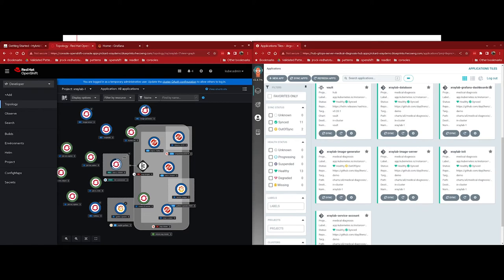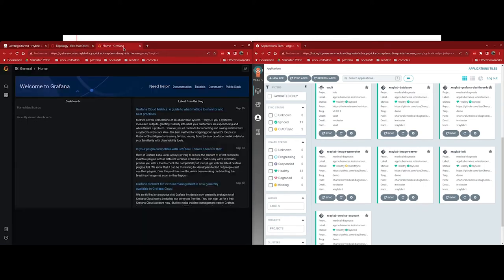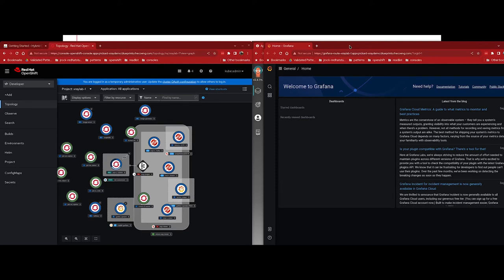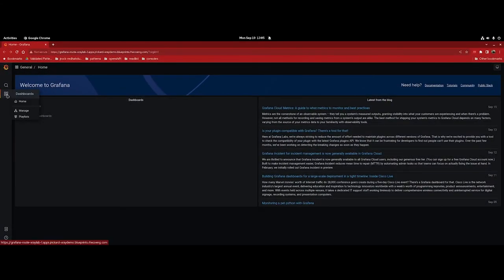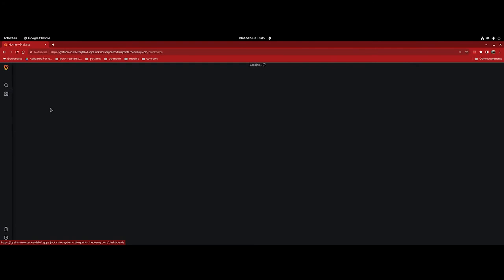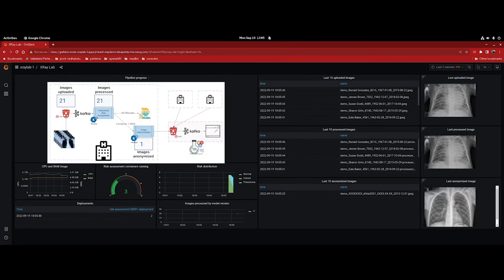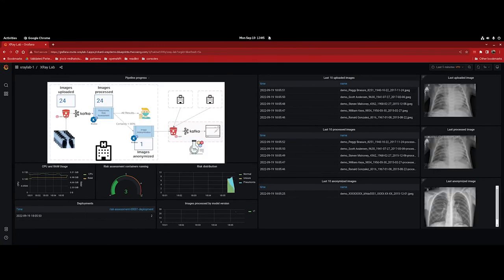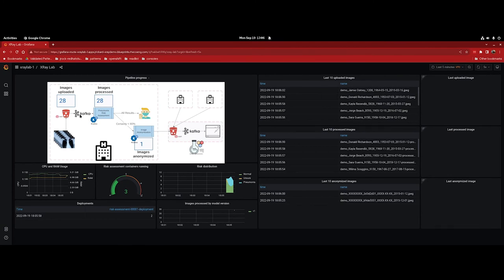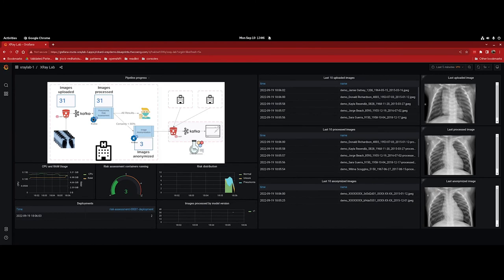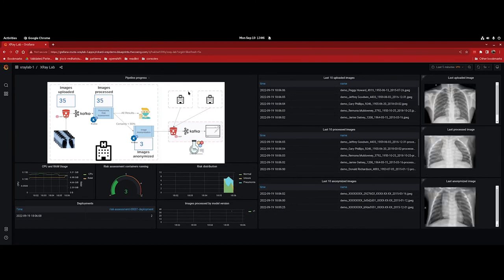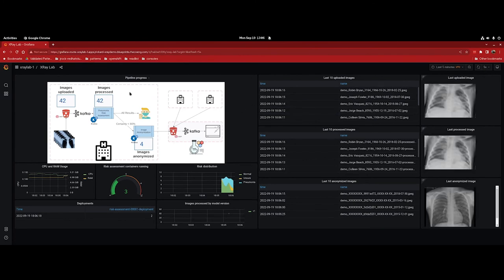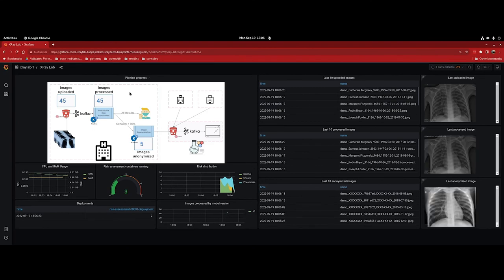So to scale the application, let's click the up arrow. And then if we take a look at our topology, we can see that the image generator donut is going to start turning dark blue as the pod starts scaling up. Once the image generator kicks off, the next thing that we'll see is the risk assessment application start to spin up as well. So going over to our Grafana dashboard, let's take a look at the images coming in. Let's go full screen, click on the four squares, let's click manage, and then click xraylab-1, and then xraylab-1. Now we are presented with our dashboard. And we can see that we have images coming in. Now those x-rays that we see are coming from AWS S3.